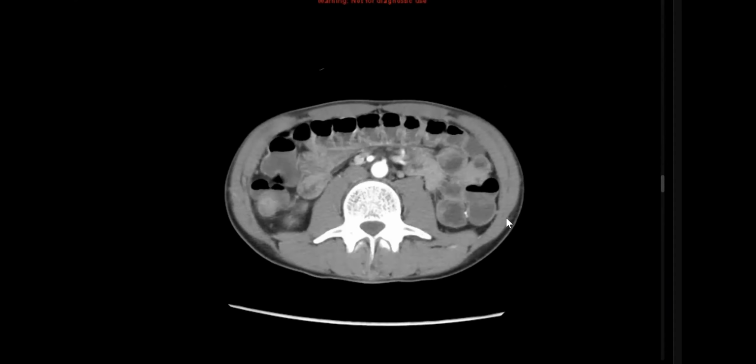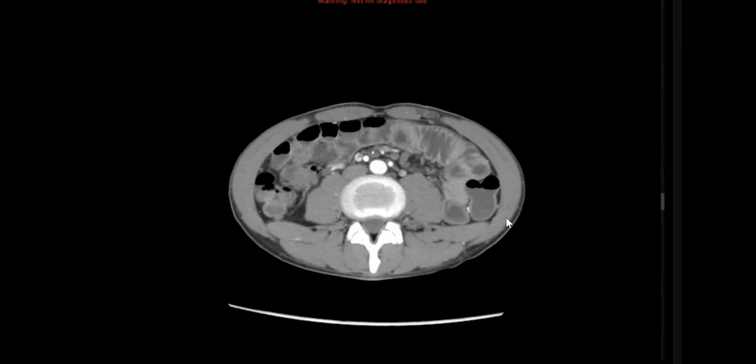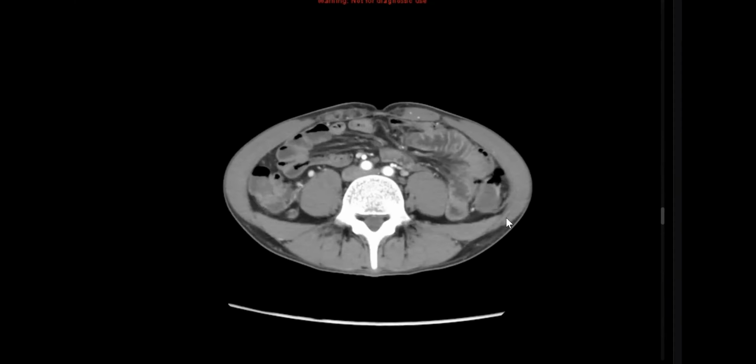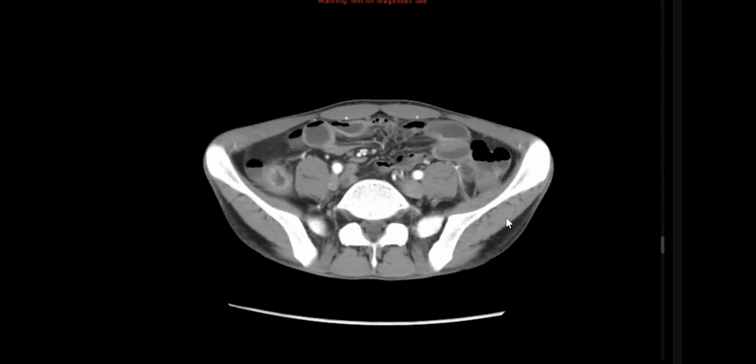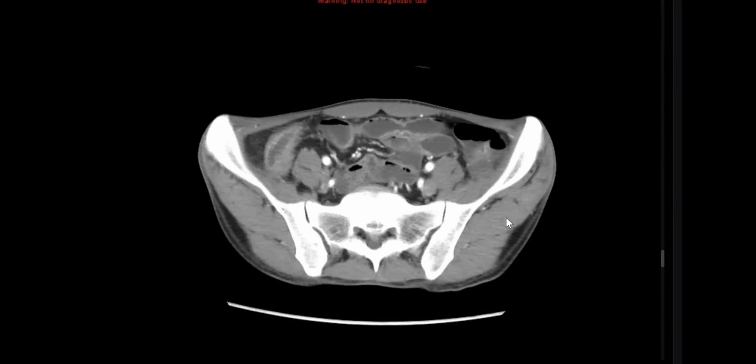I'll check if there are any fistulous tracts or abscess formation. I would like to turn to the appendix as well. Mention normal appendix, no obstruction. Show me the appendix. It's very important.